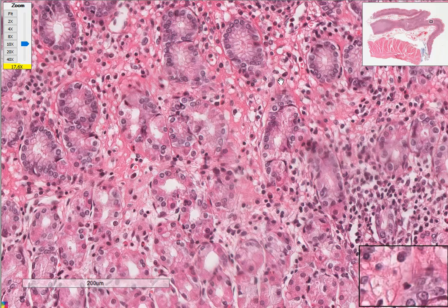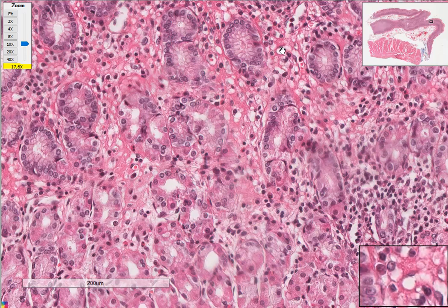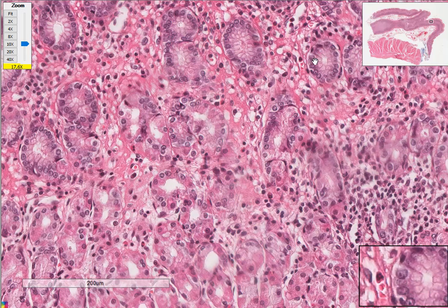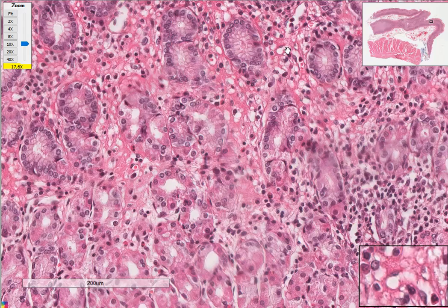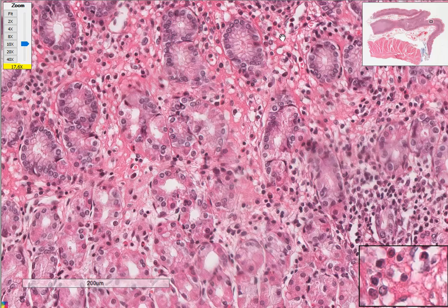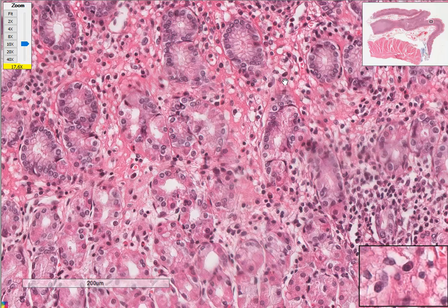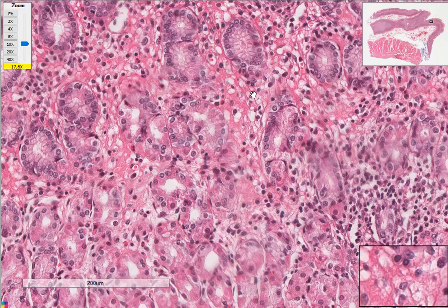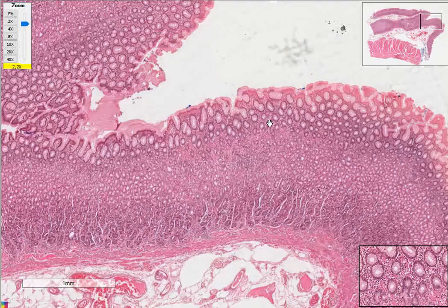Let me try and show you. For example, this gastric pit here and this gastric pit, what's between these two, these cells here, is actually the lamina propria. And then these here are lymphocytes, which I'm highlighting, with some maybe a plasma cell. This is a plasma cell, another plasma cell, but lymphocyte. This is normal in stomach histology.